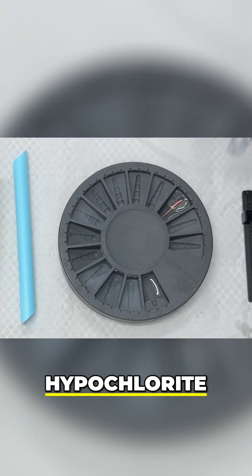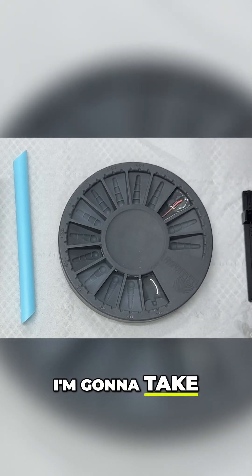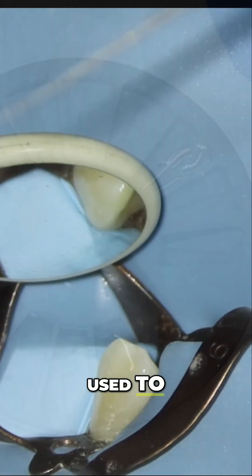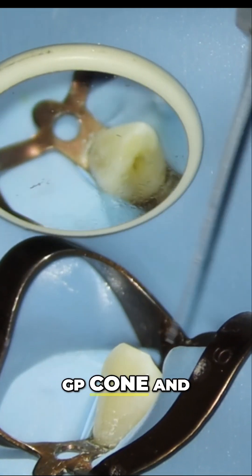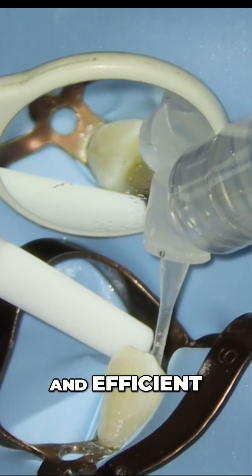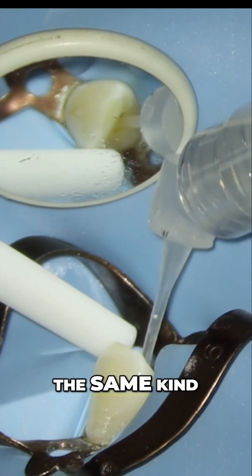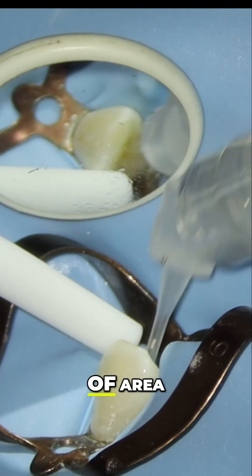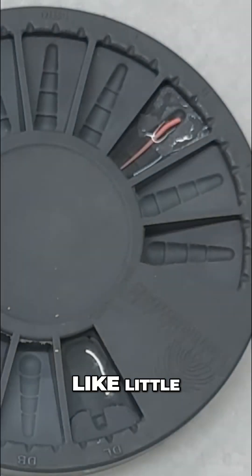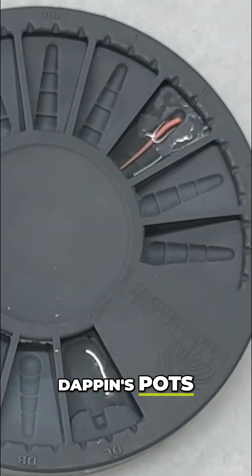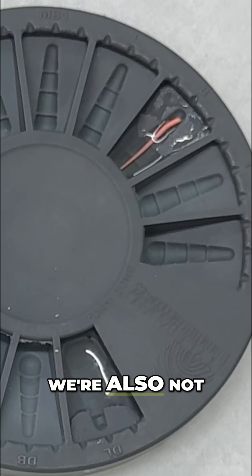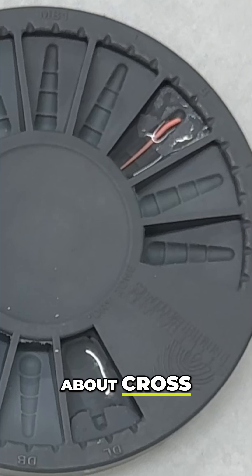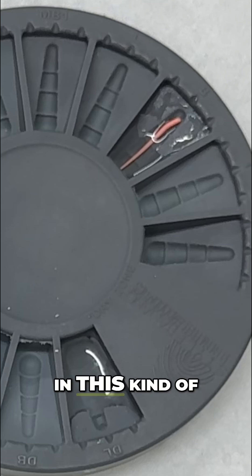I'm going to take the sodium hypochlorite that was used to disinfect the GP cone. This makes it nice and efficient. It's also all in the same area, so we're not getting little dappens pots out and we're not too concerned about cross-infection problems because it's all in this little area.